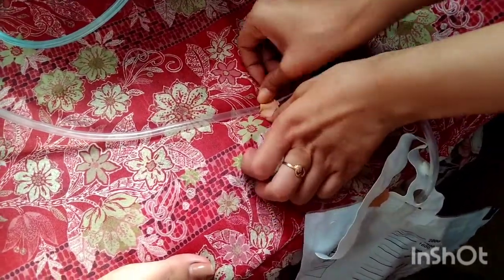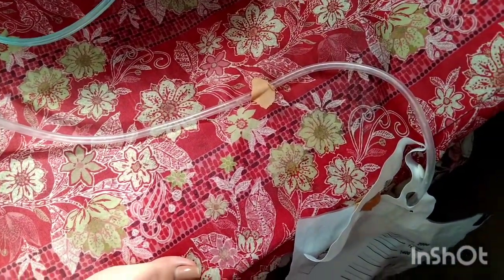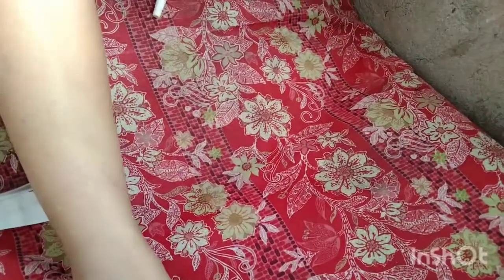Be sure there are no obstructions or kinks in tubing. Place excess coil of tubing on bed and fasten it to bottom sheet with clip from drainage set or with rubber band and safety pin. Next is to assist the client to a comfortable position. The client's comfort and security should be maintained.